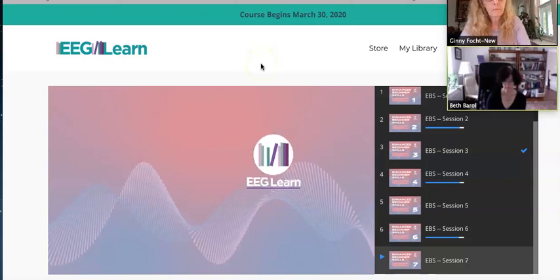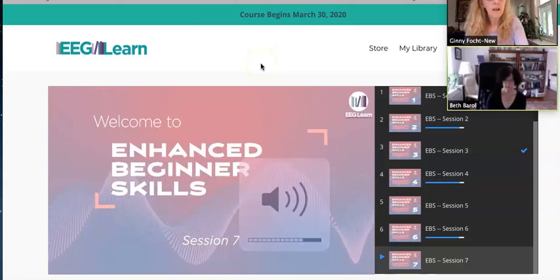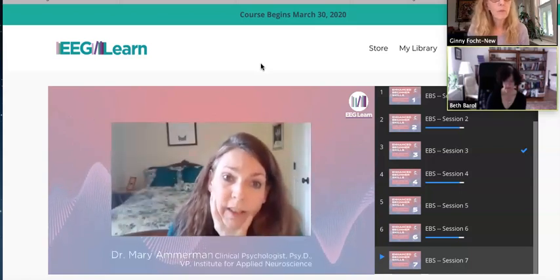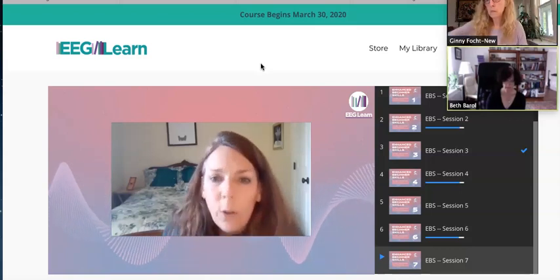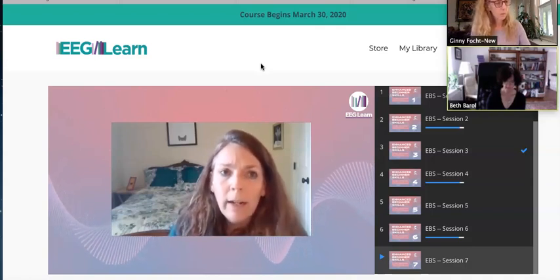All right, so we're going to continue our discussion that we started last night about different ways for managing thresholds. Okay. And first of all, I'm going to give examples for how you might want to manually set your thresholds for monopolar training.